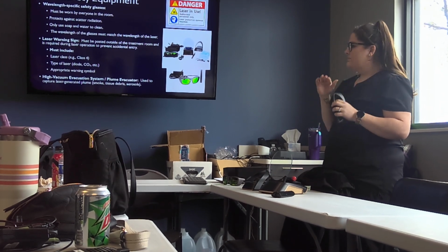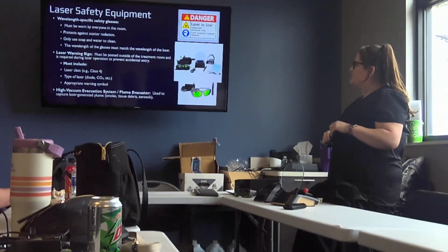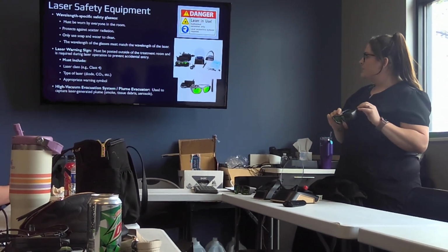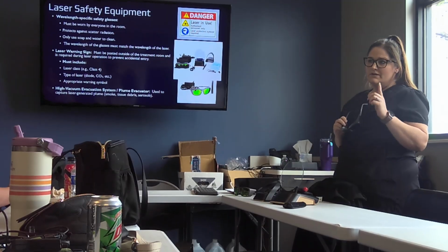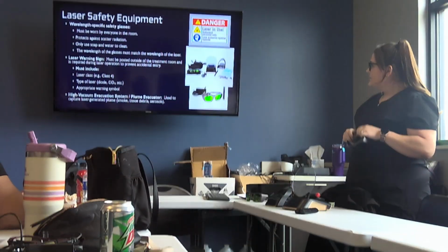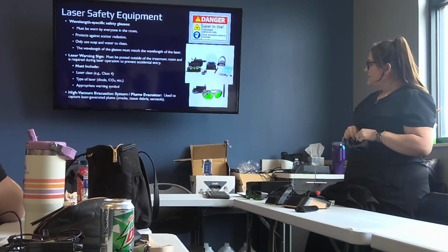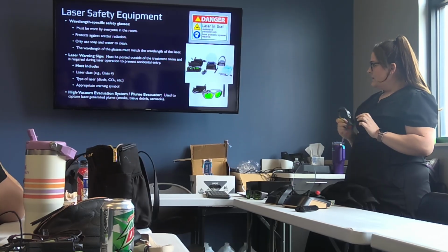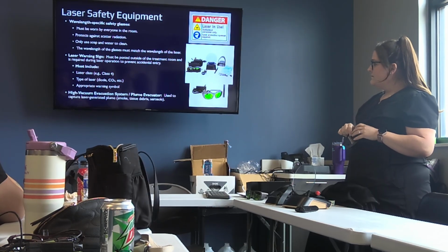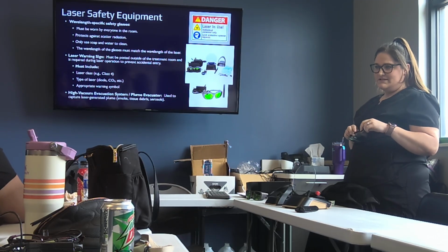And it's to prevent people from entering the room by accident without having eye protection. So these have to be worn by everybody in the room. So me, the patient, everybody in the room has to wear them. These protect against scatter radiation. And then to clean them, you can only use soap and water. And then the wavelength of the glasses must match the wavelength of the laser.